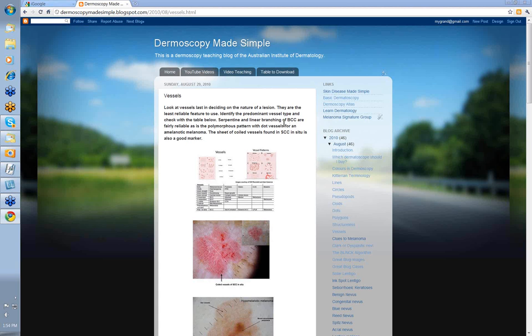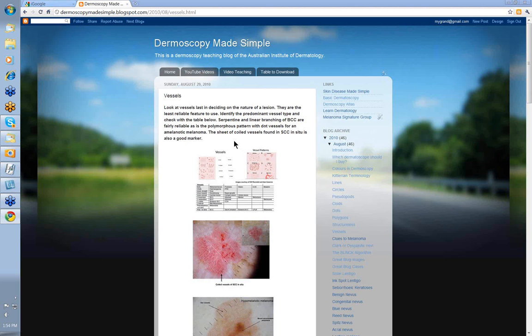Serpentine and linear branching vessels of BCC are fairly reliable, as is the polymorphous pattern with dot vessels that you see in an amelanotic melanoma. The coiled or sheet-like coiled vessels found in SCC in situ are also a good marker. So serpentine and linear branching of BCC, polymorphous with dots for an amelanotic melanoma, and coiled vessels in SCC in situ are all pretty reliable.